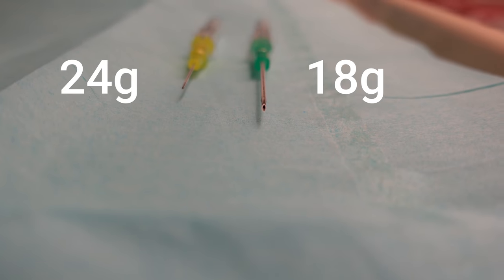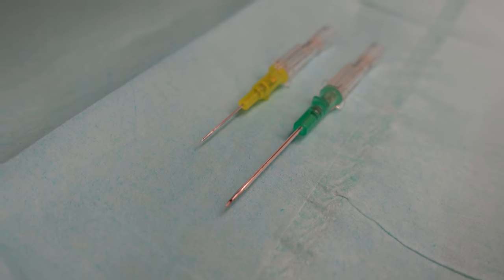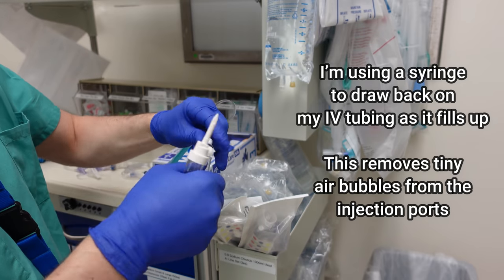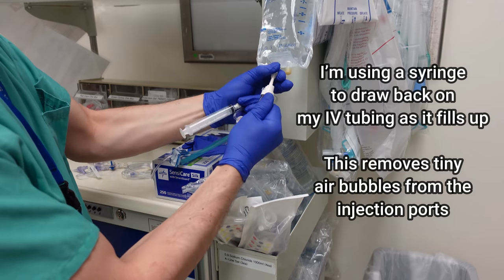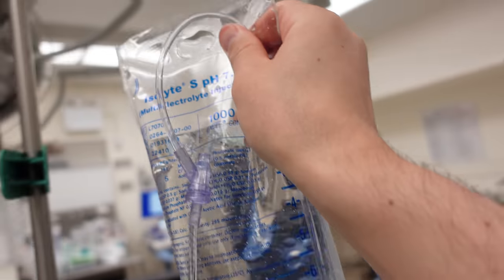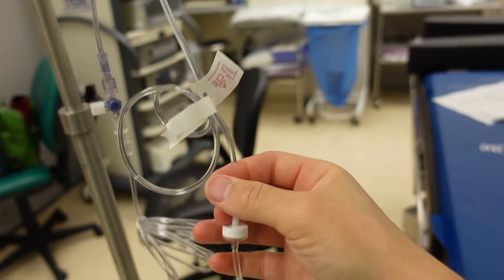The I in the mnemonic stands for IV. The 24-gauge IV we typically use for pediatric cases is significantly smaller than the 18-gauge IV commonly used in adult anesthesia. Perhaps the most important part of the IV setup is making sure there is absolutely no air inside the IV tubing. Some kids can have undiagnosed septal wall defects — a hole in their heart — and if an air bubble were to cross to the other side of the heart it may travel to the brain and cause a stroke. That's called a paradoxical embolism, and it's critically important that we de-air our IVs to avoid paradoxical emboli.